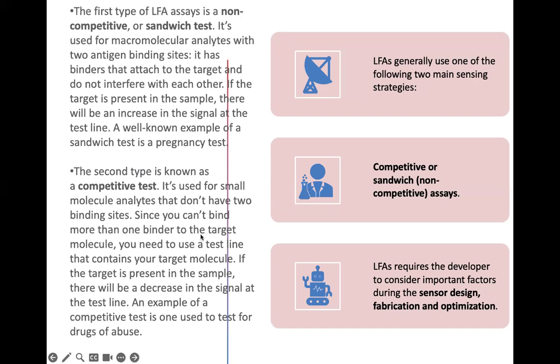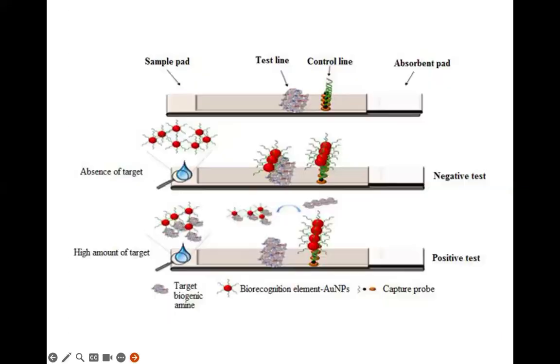But to my knowledge, from my reading, competitive assay is supposed to be much more sensitive and use less antibody compared to non-competitive assay. So it's your choice. You can choose either competitive or non-competitive assay.